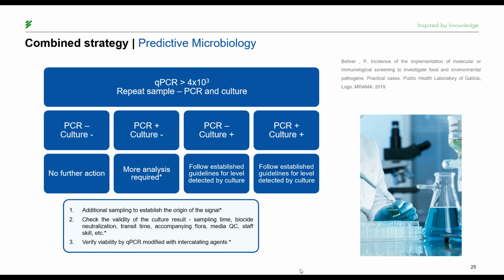So you have to verify what might have happened, if you have a false PCR positive, or maybe some inhibition in the culture method. This has to be analyzed.